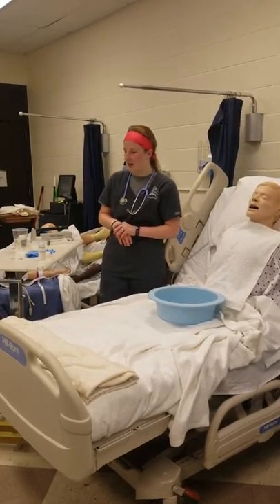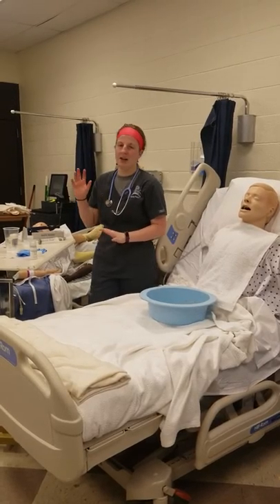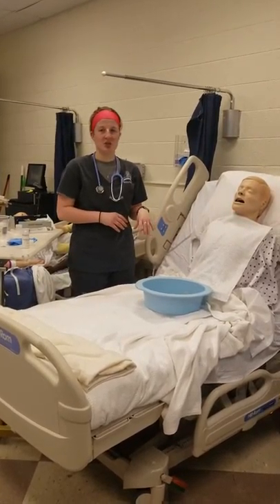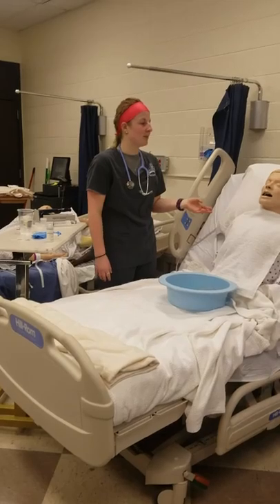Whenever I would go into my patient's room, I would make sure that I had all my supplies gathered. I would walk in, perform hand hygiene, introduce myself to the patient, and check two patient identifiers. I would double check my physician's order, and then let them know that this is going to be an uncomfortable procedure.